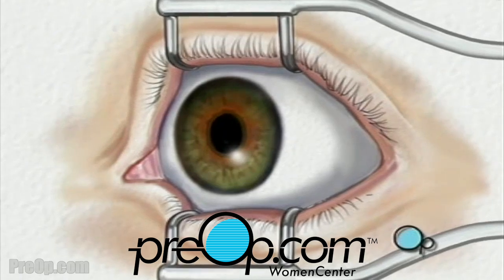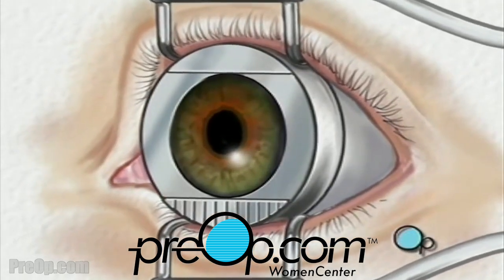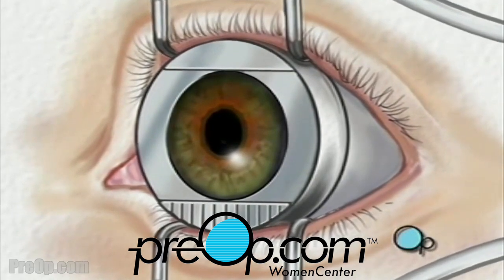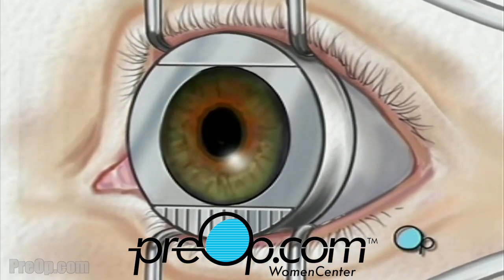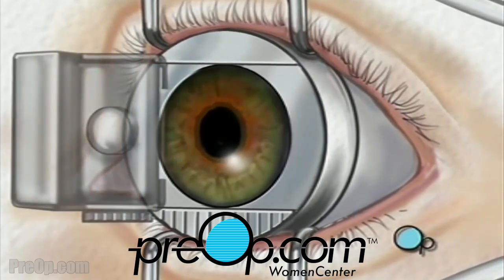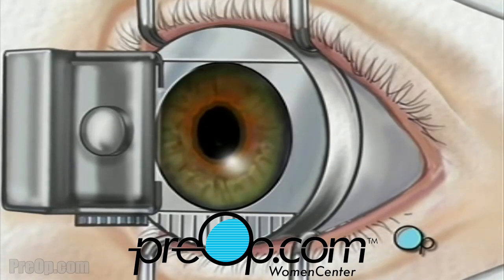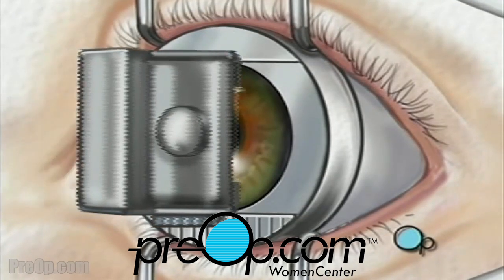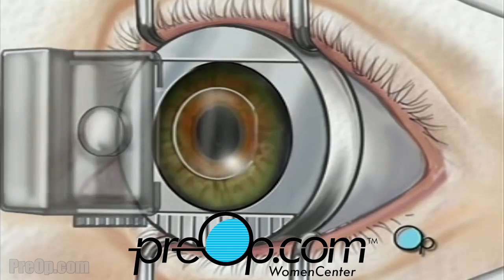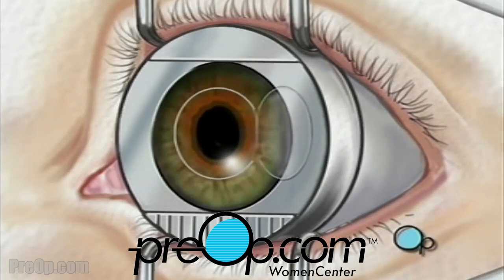And a suction ring will be placed on the eye to prevent movement and to maintain pressure within the eye. When the operative field is numb, the doctor will use an automated microsurgical instrument called a microkeratome. This tiny instrument will carefully create a thin corneal flap which remains hinged to the eye. Underneath this flap, the inner layer of the cornea, called the stroma, is exposed.